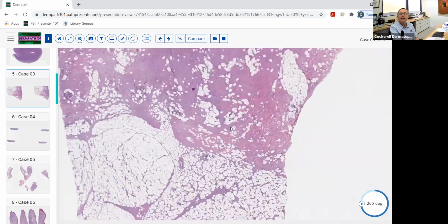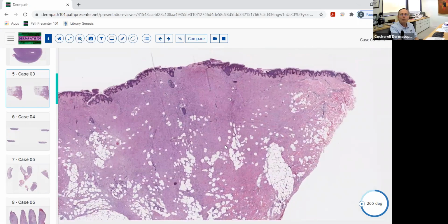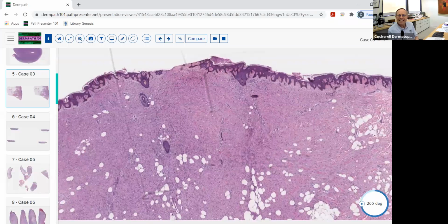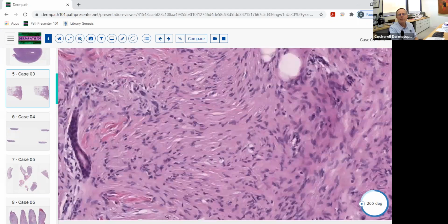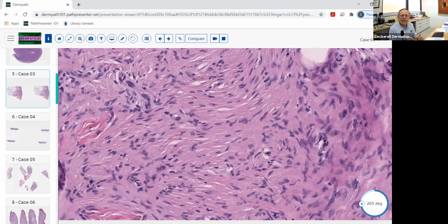Now, a lot of people say that the differential diagnosis of dermatofibroma is dermatofibrosarcoma protuberans, but it really isn't the differential diagnosis of DFSP. They really don't look the same under the microscope. If you did a shave biopsy of this, maybe some of it looks a little bit similar, but as you look at this higher magnification view here, there are not the angulated, jagged, large, irregular fibroblasts and histiocytes in a DFSP. The cells tend to be more smooth. They're more of these elongated, almost S-shaped nuclei. It almost looks a little bit more like a neural neoplasm than a fibrohistiocytic neoplasm.